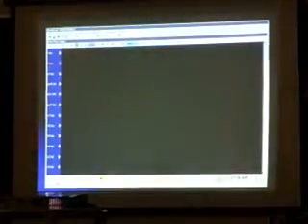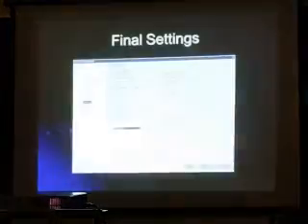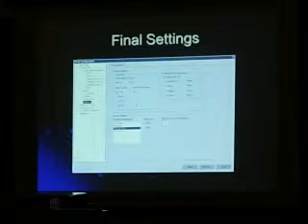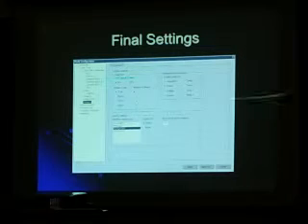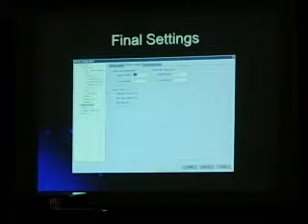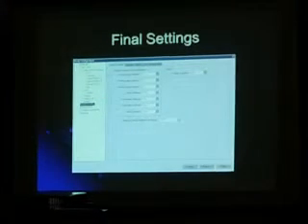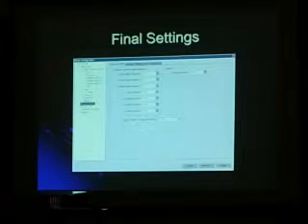And then you would just decide where you put everything on here. Obviously, a 12-lead page. Final settings you can go through depending upon the system. Tell it what ablation device and what information it's going to record, when it's going to do certain things like save arrhythmias, high heart rates, lower heart rates. What channel is the atrial and HIS and ventricular, if it's going to automatically mark those locations for you and do timing measurements for you automatically.